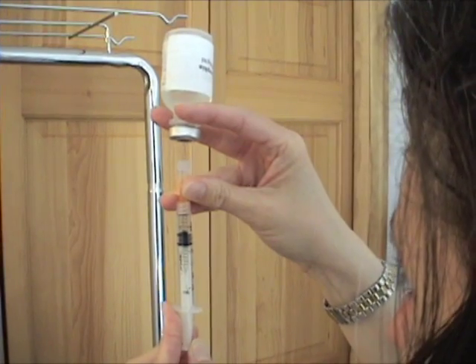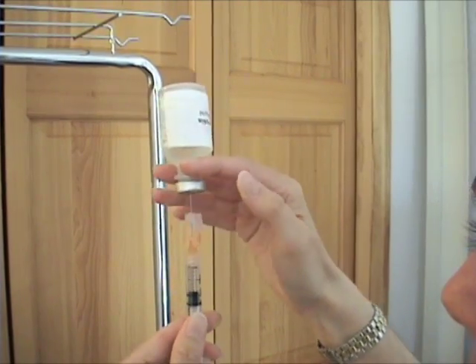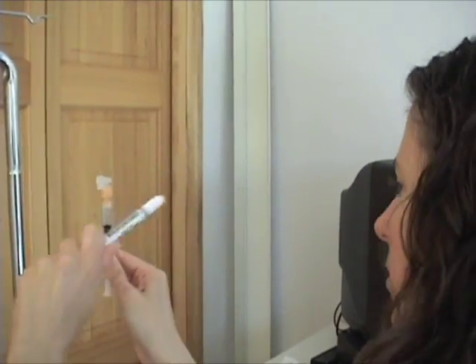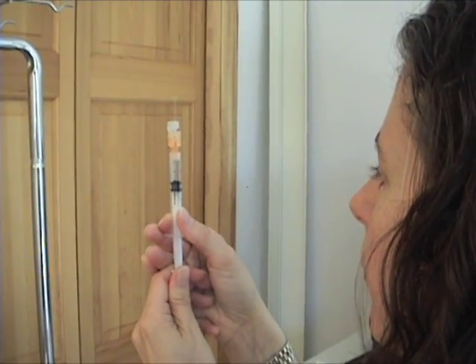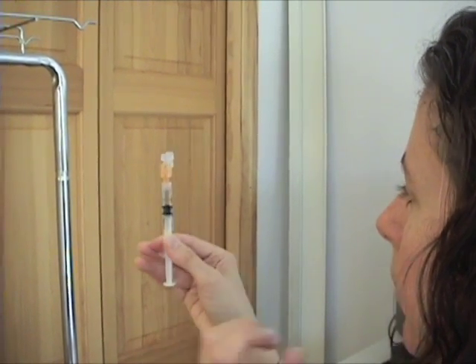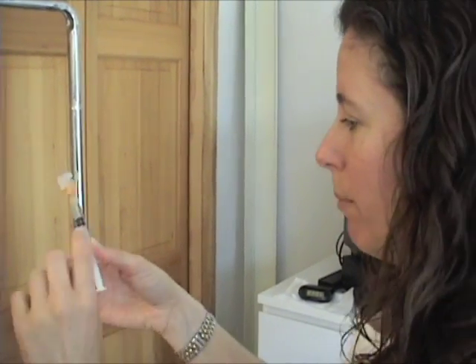I can see some big bubbles here, but what I'm gonna do is draw a little extra so I can expel the bubbles. That we won't be able to do with the second medication, so it needs to be really exact. Okay, here we go. Show the C that you have to verify that you have the right amount.